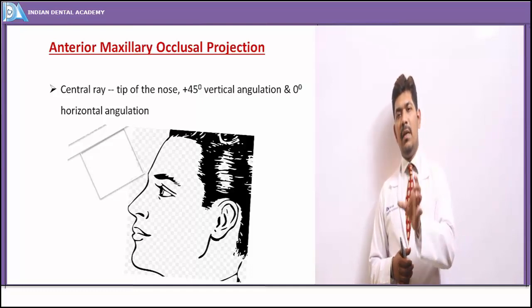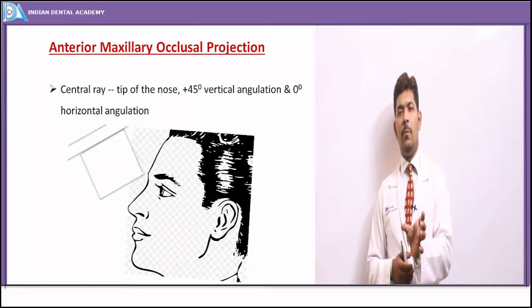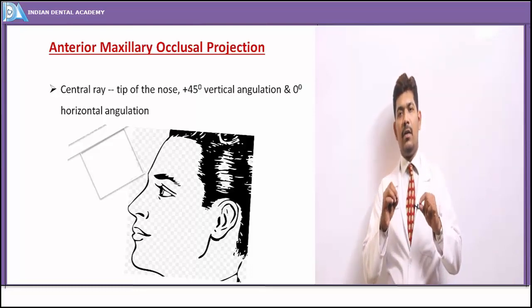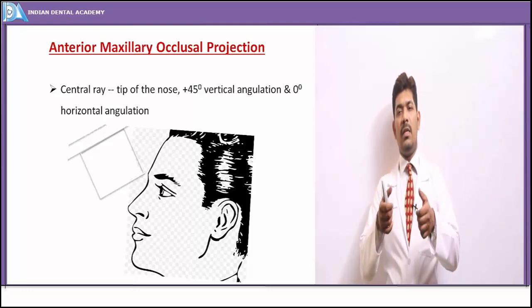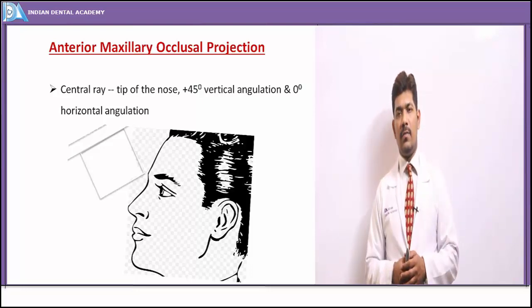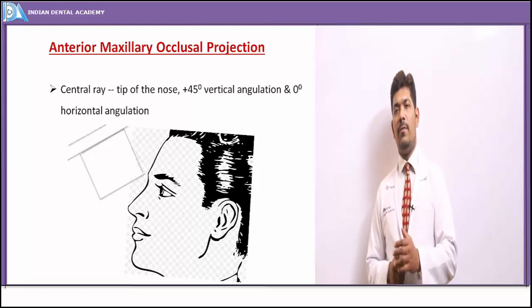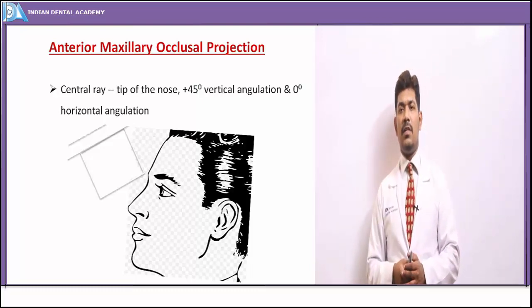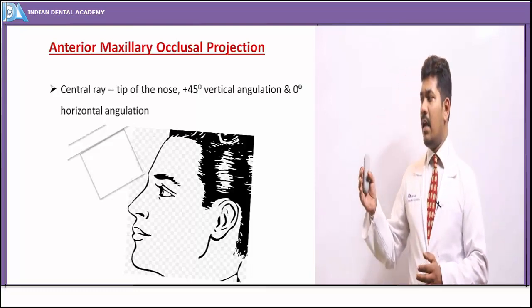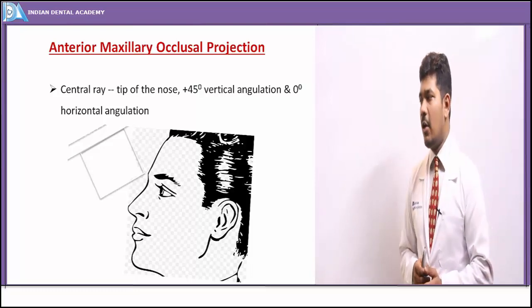and then to stabilize this occlusal radiograph within the occlusal arch, the patient is asked to slightly bite onto the occlusal film, or the operator might use both his thumbs to stabilize it against the occlusal arch. So that would be the positioning of the radiographic film inside the patient's oral cavity, and the positioning of the X-ray cone.